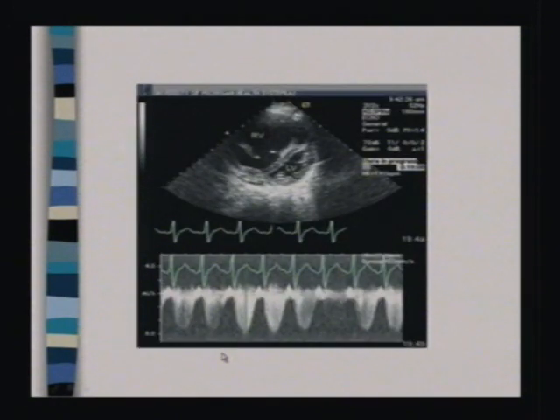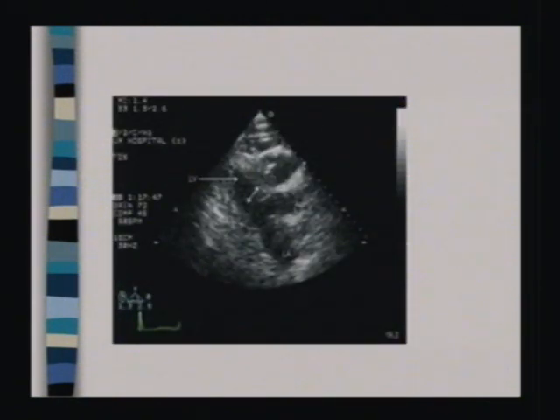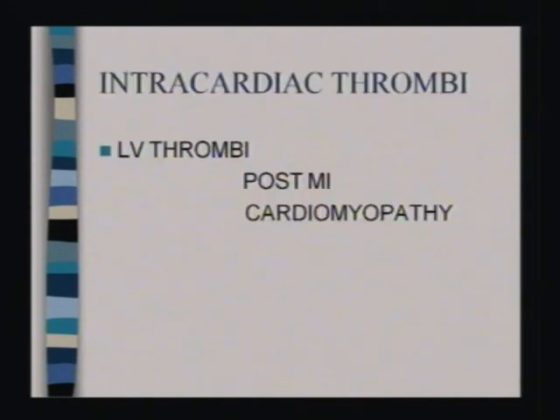This is a patient where you can see the dilated RV and RA, severe PH as calculated by the TR jet, and there was RV dysfunction in this patient. This is a patient with hypovolemia. You can see a small LV and a small LA, and there was normal function in this patient, but you can see the difference, the LV and LA are so small.